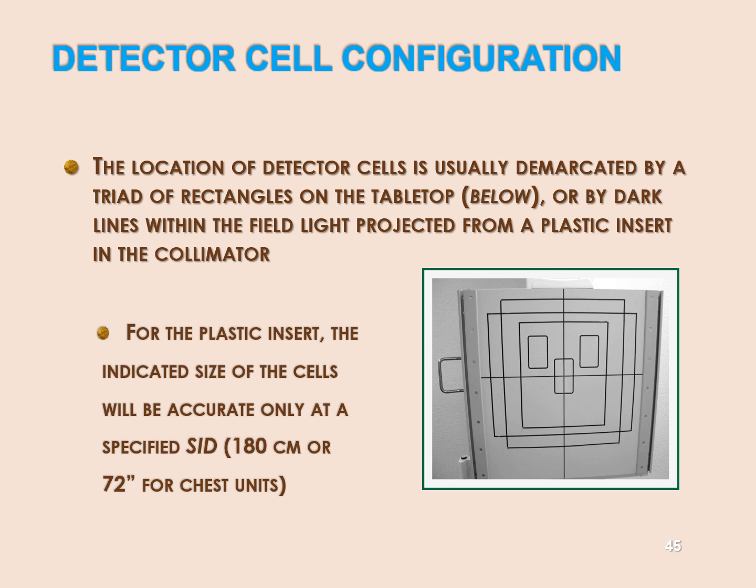So different projections require different active cells, and he goes into this big spiel about you should really use center cells for PA chest. I disagree. Okay, maybe it's just here in the South we grow the people a little bit bigger. I've never had the problem he describes where part of the chambers is over the mediastinum. I've never had that happen. Okay, usually my chambers are over the middle to upper lobes, so I'm not sure.